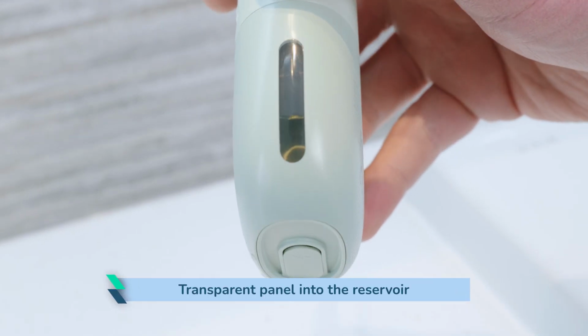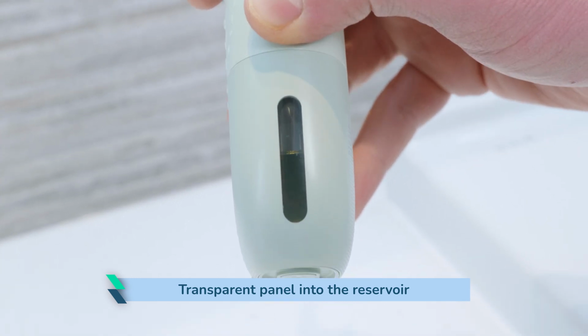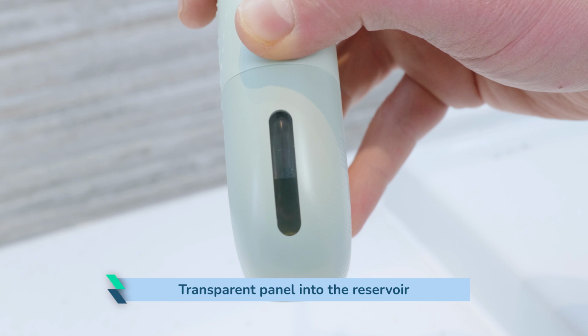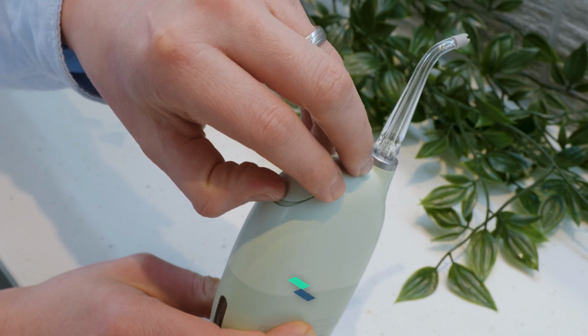There's a transparent panel into the reservoir, which looks different, but honestly, kind of pointless. You can't see it during use, it only becomes useful when the water's already low, and if you're like me, you'll top it up before using anyway. The reservoir cap isn't difficult to release and has good movement.